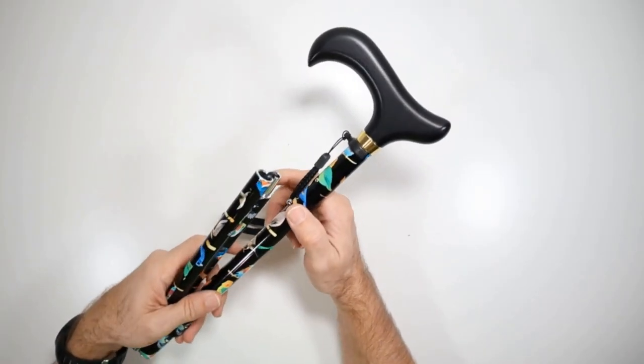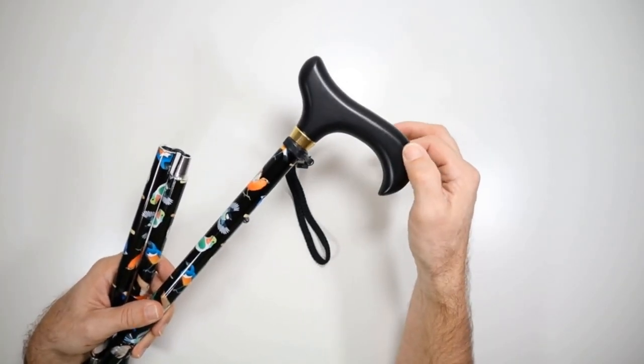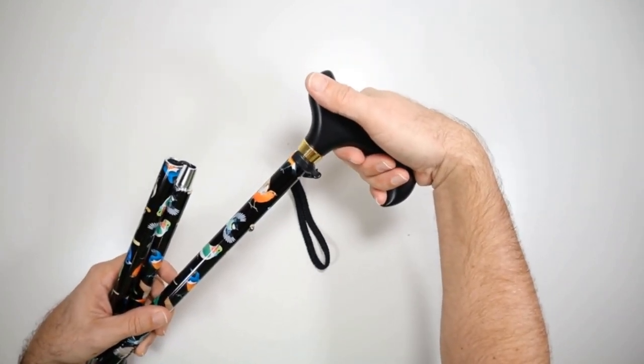So taking a closer look at the EasyFold cane, it does have the Derby style handle. This handle is designed to fit naturally into the curve of your hand.